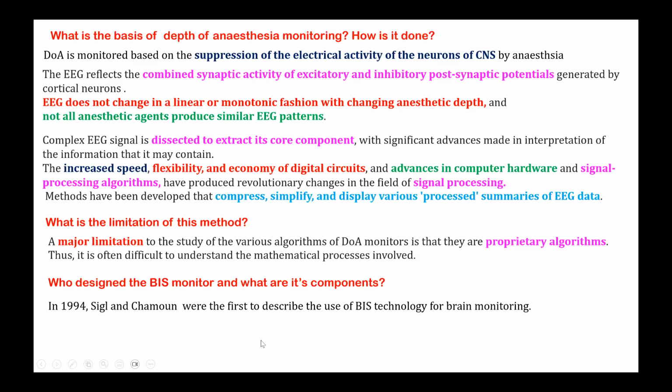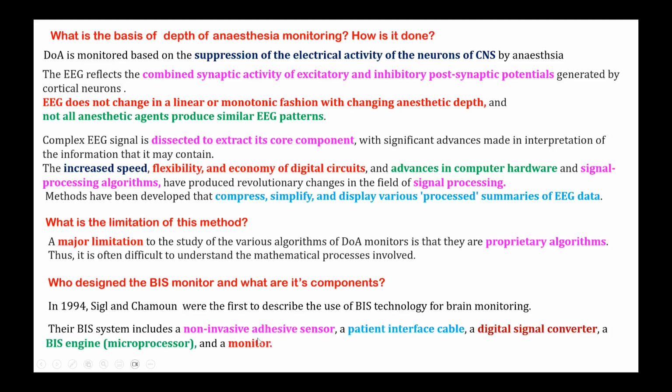The persons who described this were Sigl and Chamoun, and it has non-invasive adhesive sensors, a patient interface cable, a digital signal converter, a microprocessor and a monitor. These are the components of this monitor.